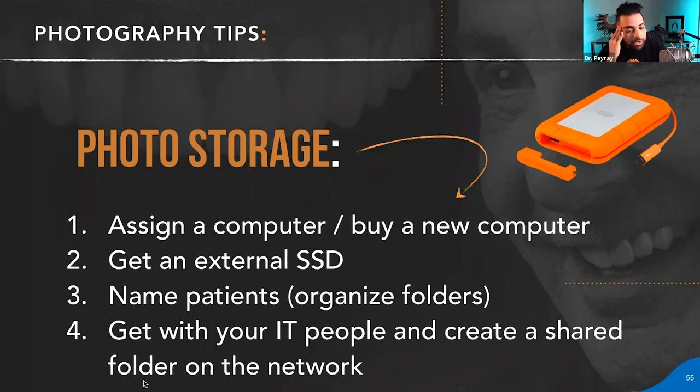And the last but not least, which I think is so important, is get with your IT people and create a shared folder on the network of all your computers. For example, when I take a picture or do an intraoral scan, I like to save that STL on the computer, but then I want to access that STL from all the computers in the office. So we have a shared folder on the network that my lab can connect with, where all my scan data, my intraoral scans, and my photos are saved. So no more going through a bunch of different companies. This has honestly helped all my team members to communicate and keep track of things.